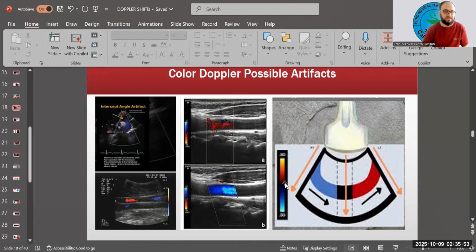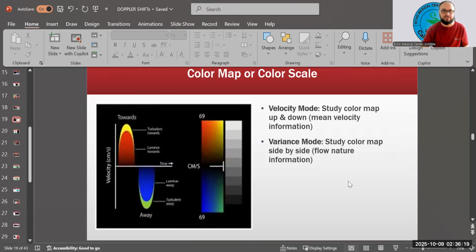Remember, this area is a baseline. So here you have a reflection. Keep in mind, for your reference, you have a reflection, but transmission and reflections are equal. That's why you don't see the difference. They're equal. So we can say 5 minus 5 is 0. Correct? So you don't see any Doppler shift on that area. Do not scan with a 90 degree angulation.